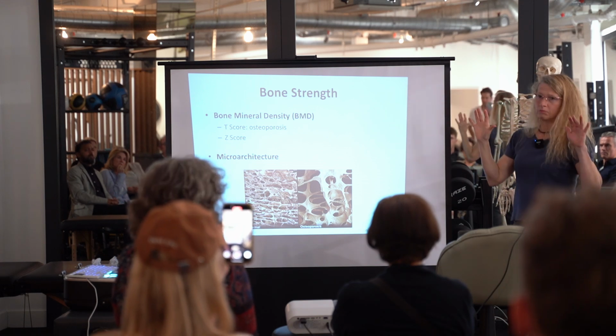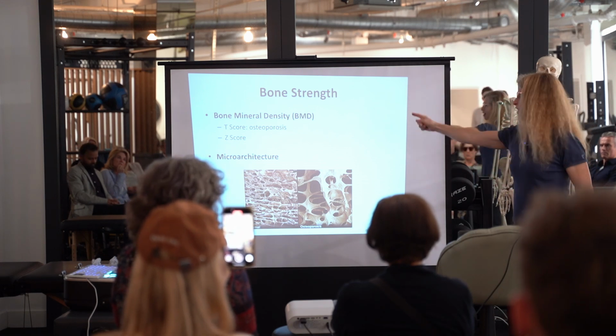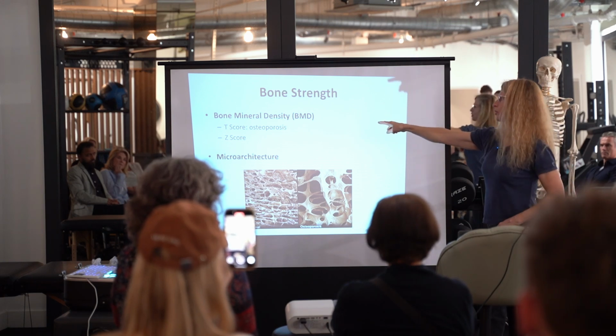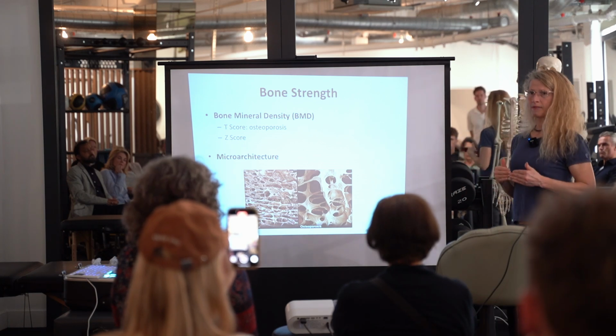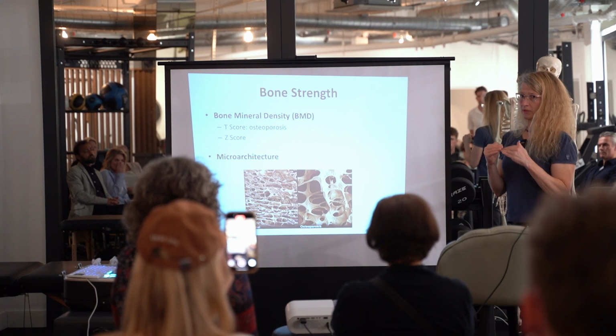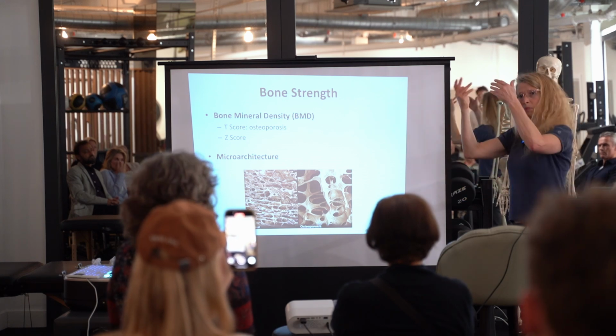These are, without getting too technical, they won't have dimensions on them because they're standard deviations. So how far are you away from what we think is the peak, and how far are you away from what other people of your age have? In basic terms, if it's 0, it means it's exactly what we'd expect. If it's negative, it's lower than we'd expect, and if it's positive, it's above.